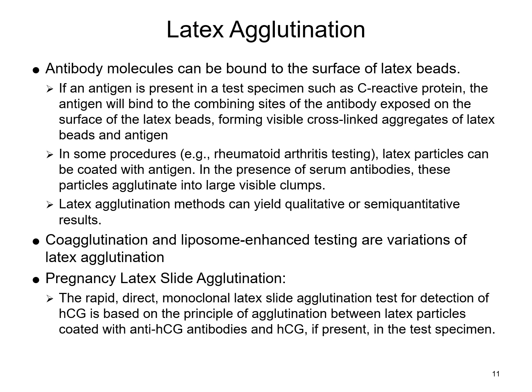Now, in some procedures, you may have those latex particles coated with an antigen, so that if they're exposed to the antibodies present in the serum, then you again get that aggregation of those antigens and antibodies, and you're going to start seeing those visible clumps.